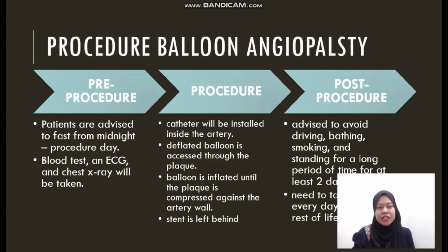There are three stages in the procedure of balloon angioplasty. The first one is pre-procedure, then procedure, and then post-procedure. In the pre-procedure, patients are advised to fast from midnight until the procedure day. This is because a blood test, an ECG, and a chest X-ray will be taken. Therefore, eating can affect the result of the blood test.